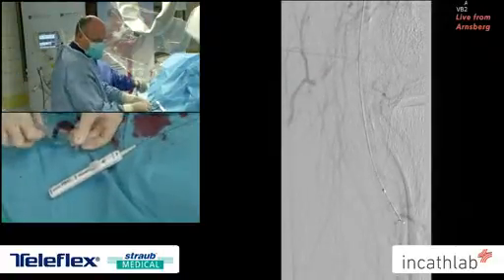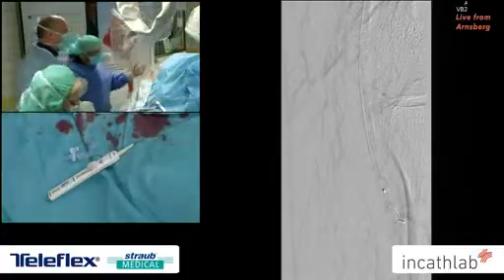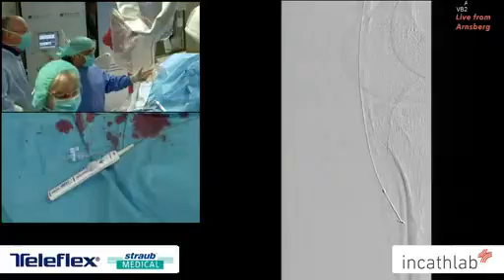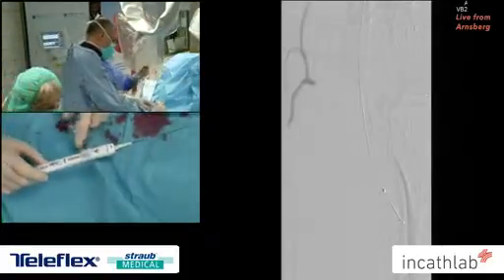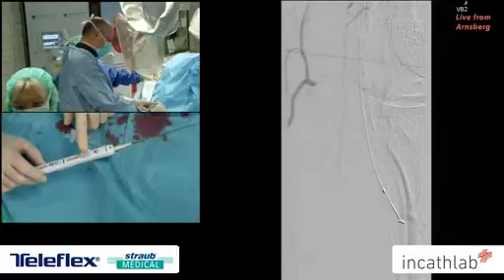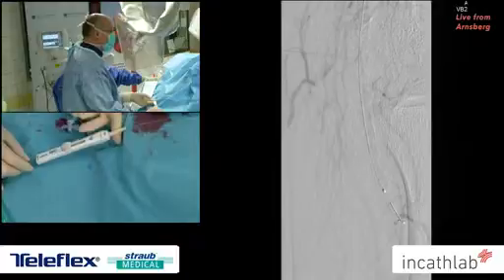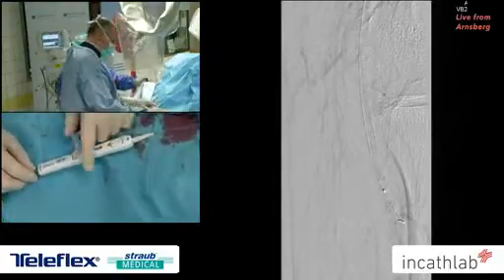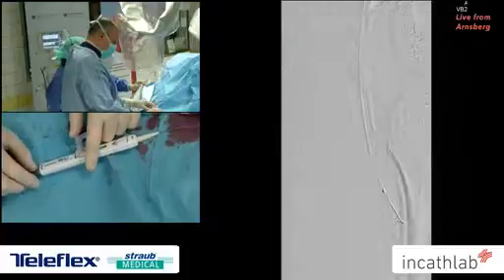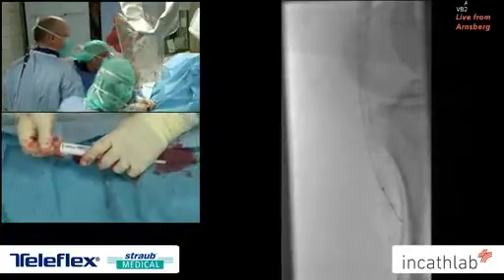But another opportunity is to inject drugs directly, such as a dilator, even thrombolytic drugs, through the balloon in order to have a more favorable outcome and a more favorable opacification of the occlusion and the area below the occlusion.